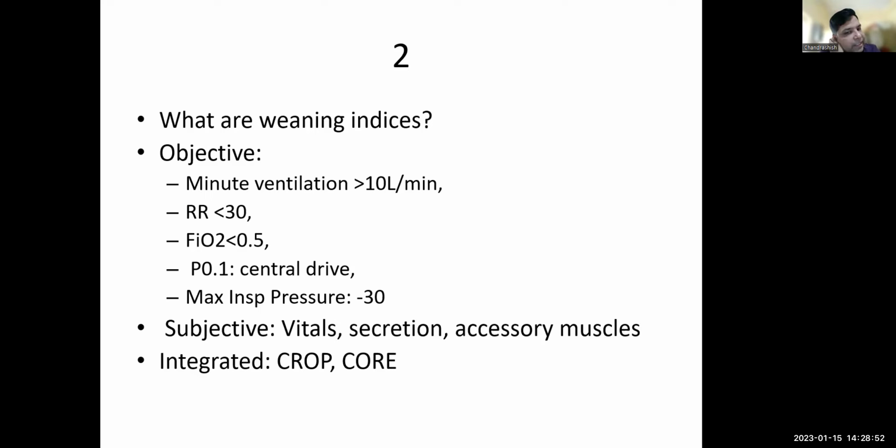So you can check the maximum inspiratory pressure, MIP. These are things which can be done in certain ventilators. You have knobs, you have options, just press it and the ventilator occludes the valves and gives you a number. But again, remember, these are very variable. The numbers will change. So always take multiple readings and then take an average. We don't decide from just one reading.